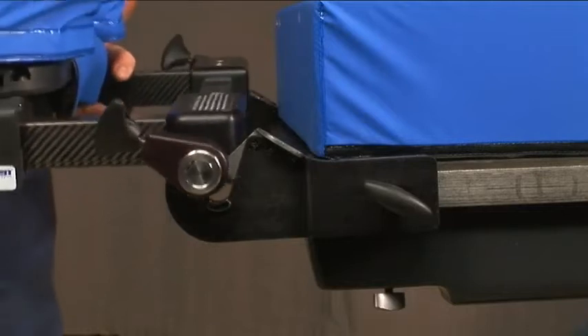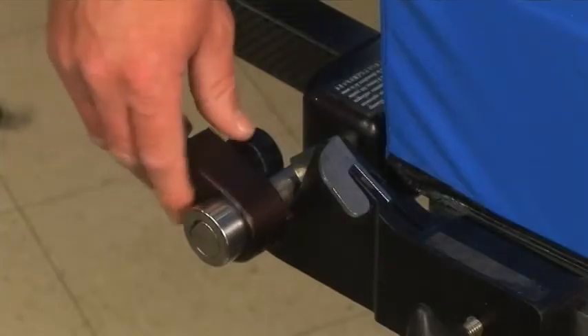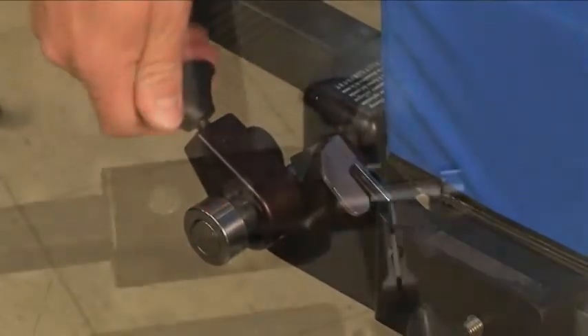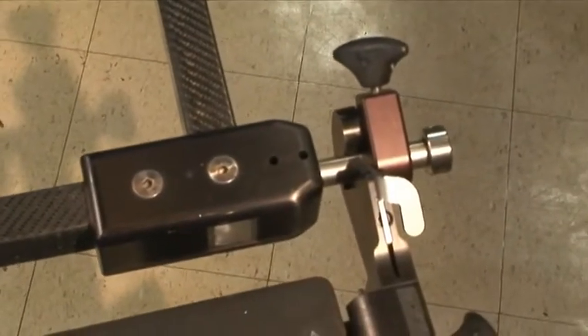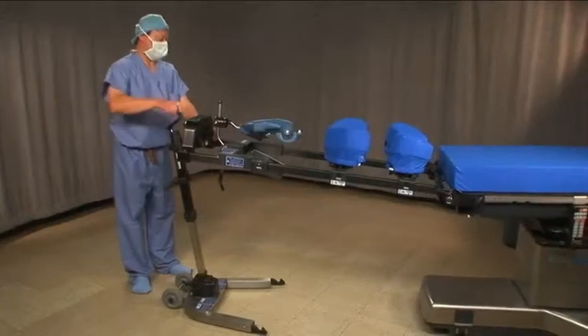Drop the pins into the clamps — you should hear a click as they fall into place. Slide the teardrops flush against the clamps so that the frame is secured laterally. Tighten the knobs. Both teardrops must either be on the inside or both on the outside of the clamps. Experiment to see which configuration will work best with your OR table. Lower the frame until it is level with the table.